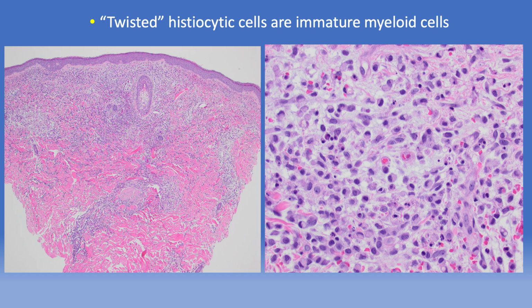And there does indeed seem to be an association between histiocytoid Sweet syndrome and having an underlying myelodysplasia. Some authorities have recently suggested that a subset of such cases might best be classified as myelodysplasia cutis.